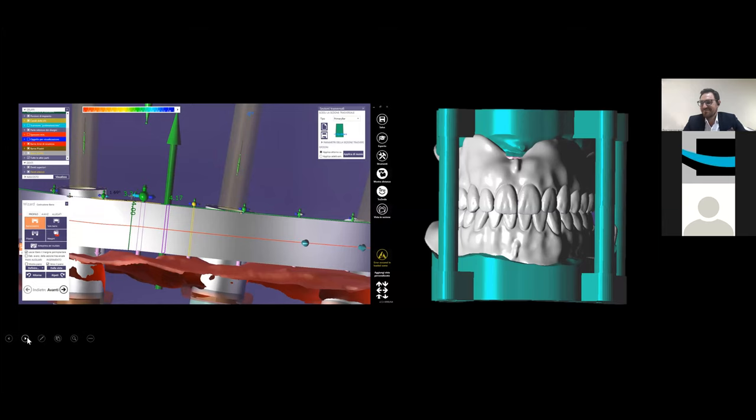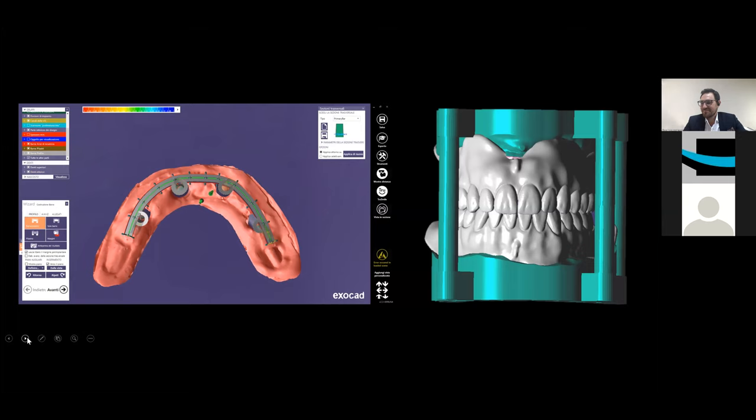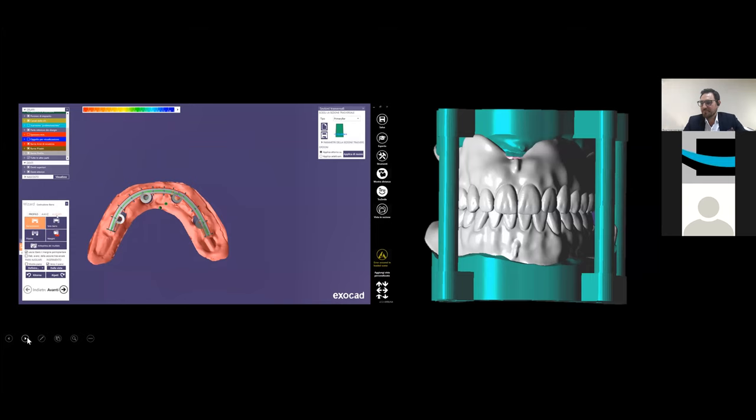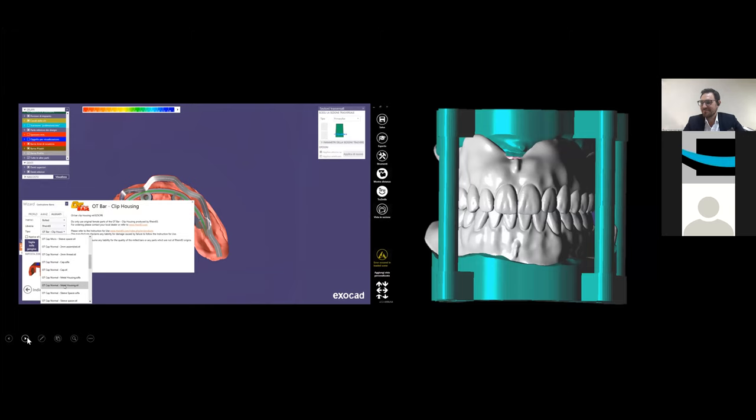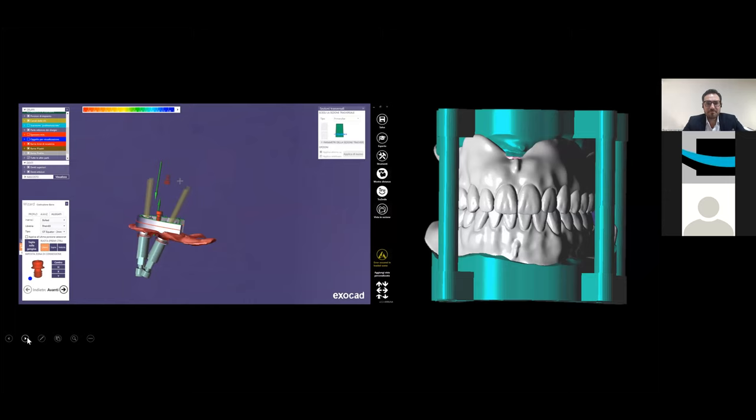As you can see on the screen, the shape of the bar is inside the final volume. So I took two images and did a virtual planning inside my system. I share all the information with my dental technician, and Marco Ortensi produced a prototype inside the 3D software and sent this information to the 3D printer. Now I share the final volume with Luca Lavorgna, and we did a CBCT. We put some implants inside the bone, and now we can produce some bars, this type of bar, okay?